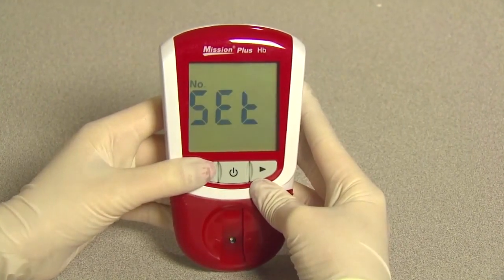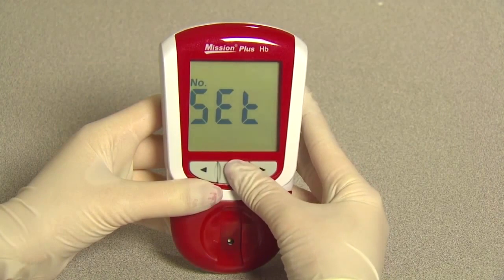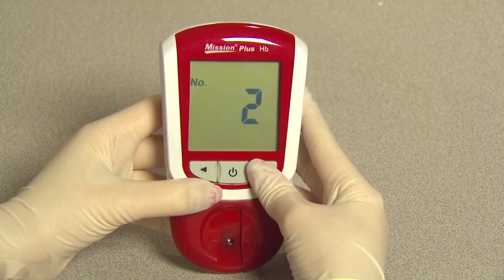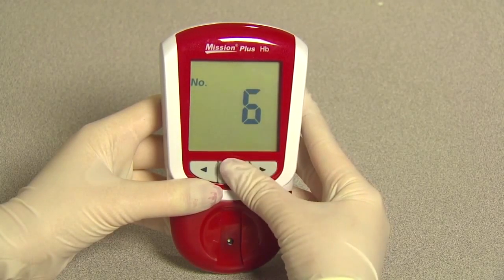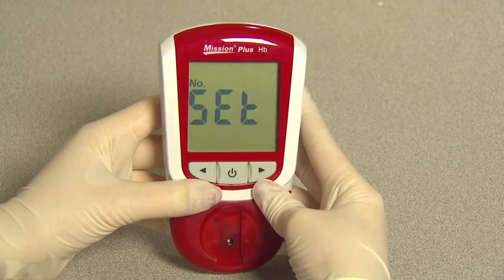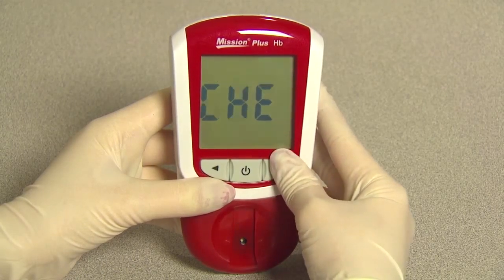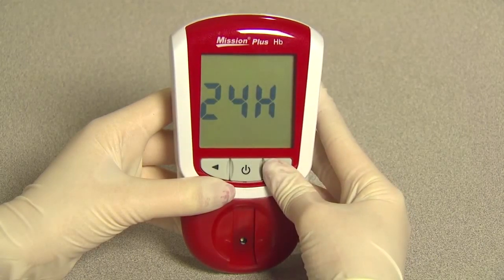From the test number setup screen, press the power button to select the test number setup in case the user needs to set the test number to a desired number. You can set the test number from 1 to 999 by pressing right or left until the desired number is displayed. Press the power button to save and return to the meter setup screen. Press the right button twice until the system setup screen appears. Press the power button to enter the system setup.